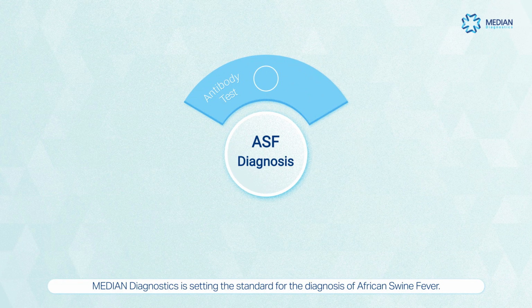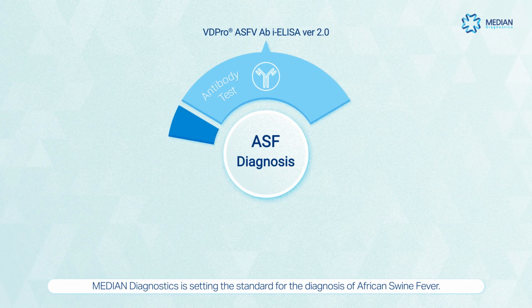Median Diagnostics is setting the standard for African swine fever diagnosis.